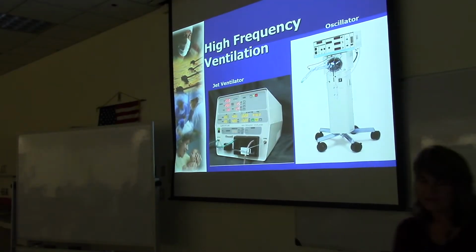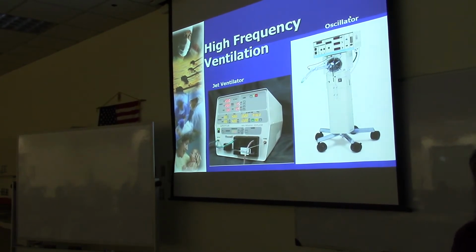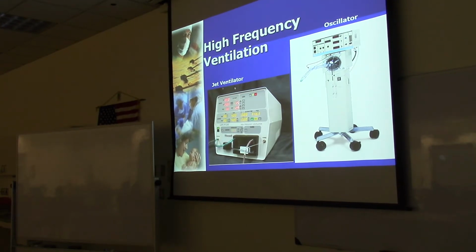Right, so to talk about high frequency ventilation, it shows the picture of the two commonly used high frequency ventilators. Again, the oscillator tends to be used a lot less nowadays, but the jet ventilator seems to be used a lot more. So we'll start off with discussing the oscillator, and then afterward talk about the jet ventilator.